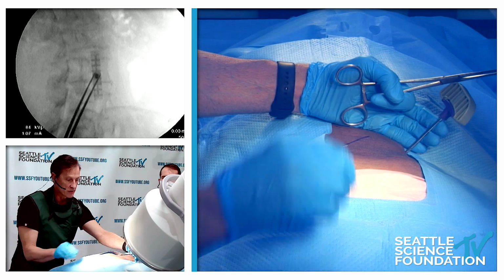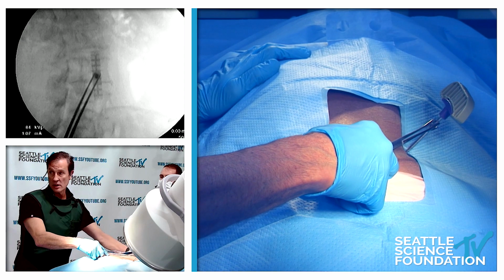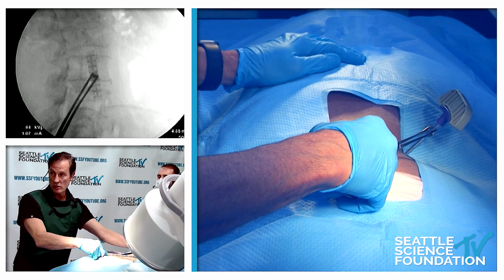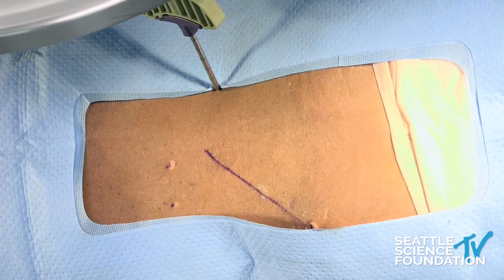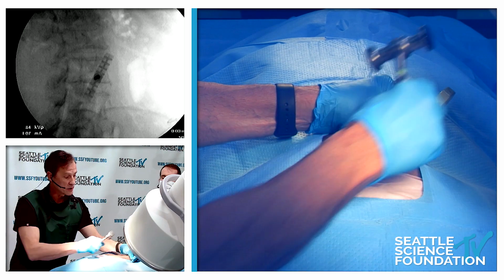And you mind those safe zones, you can drive it in and stick your thumb in the vertebral body and not cause any problems. And so we're headed right where we want to go, just above the inferior end plate. And it's a little tap, tap, check position. I'm going to go a little bit anterior.